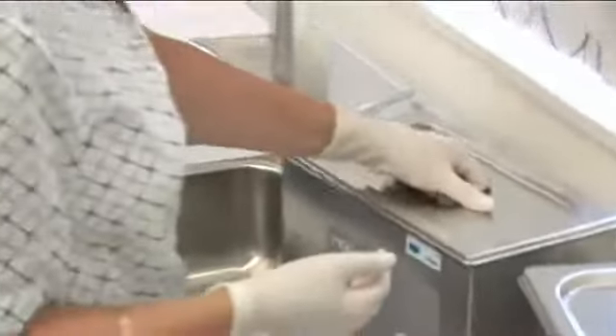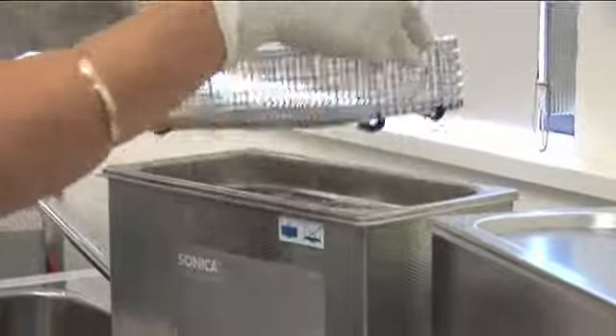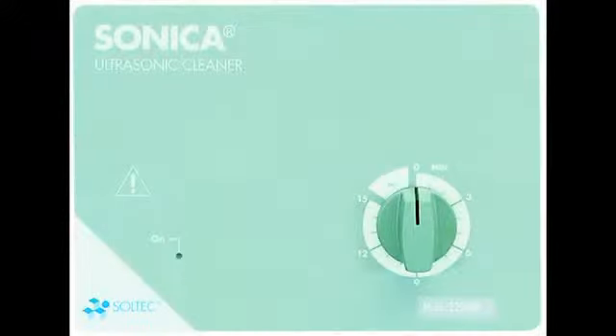All Soltec Sonica ultrasonic cleaners are supplied with a free stainless steel lid and silicone seal to minimize noise and prevent aerosol. A stainless steel basket is also provided.